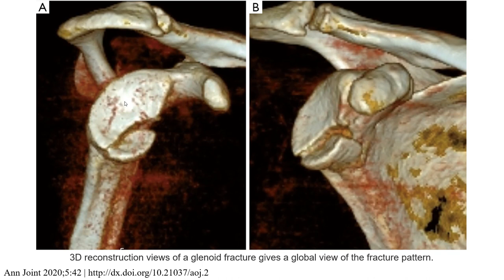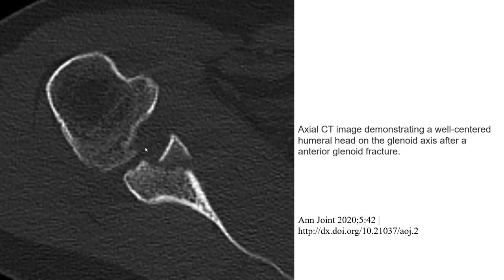This is a 3D reconstruction view of the glenoid fracture, giving a global view of the fracture pattern. As we can see here, there is fragmentation with multiple planes and a fracture line. On this image also we can see the fracture line, and this shows fracture fragmentation. This axial CT image demonstrates a well-centered humeral head on the glenoid axis. This is an anterior glenoid fracture.